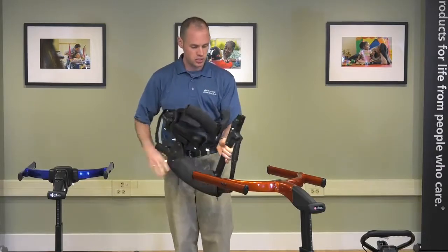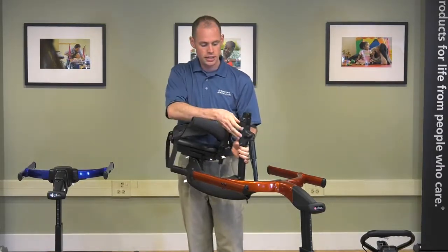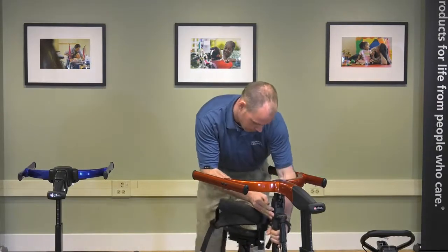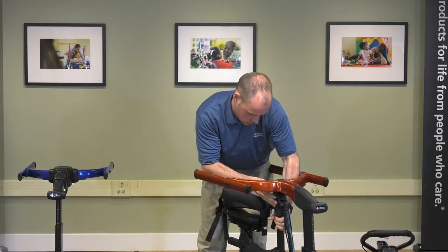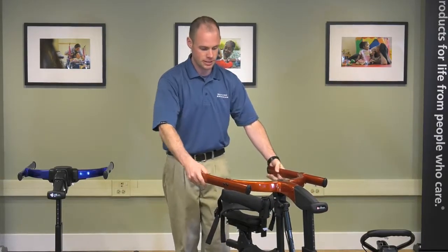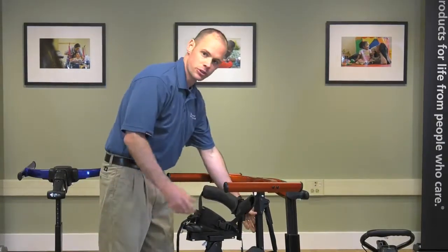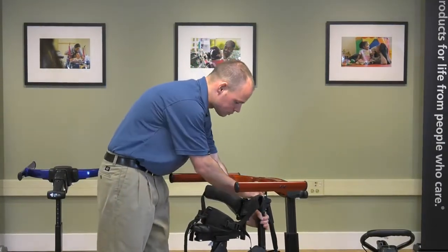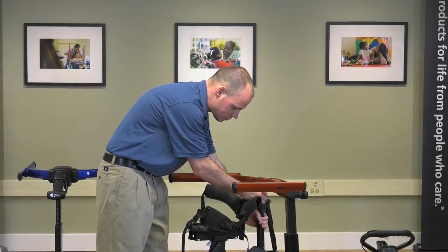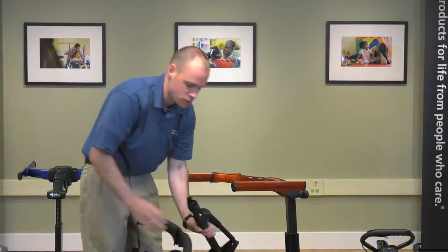So to insert your multi-position saddle into the pacer, all you have to do is press this little white button on the side, and push the multi-position saddle up into the pacer. To take it out, you just have to press the little button on the side, and then press the large button in front, and it comes straight out.